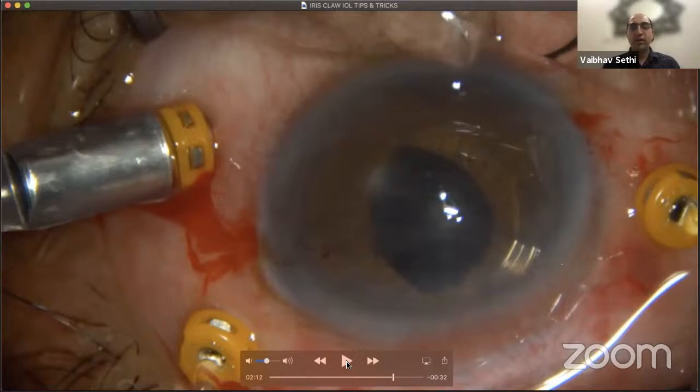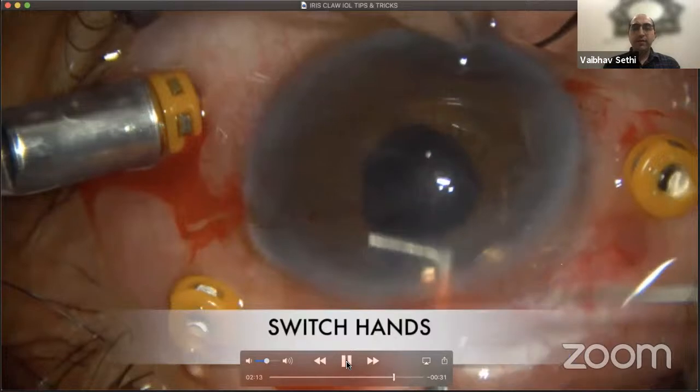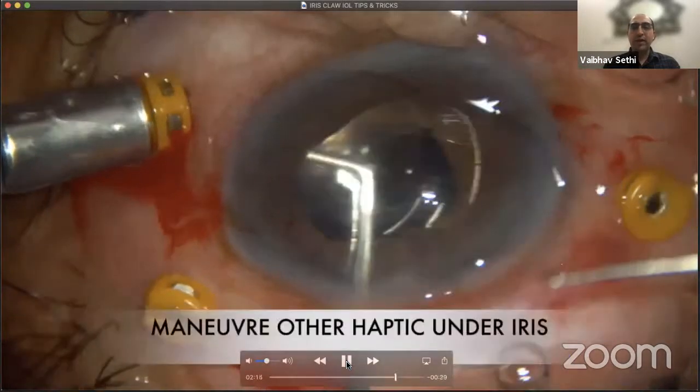That's very important. You can run over the iris tissue with slight pressure, and you'll actually feel that click or snap happening. That indicates that some amount of iris tissue is enclavated now. The more the iris tissue, the better the enclavation is. After you're done, don't go for the other side port. What you do is wait, and place viscoelastic. That's very important. Switch your hands for better maneuvering.